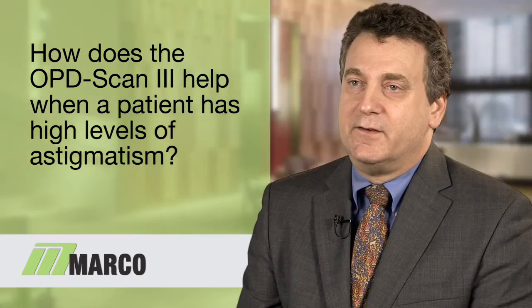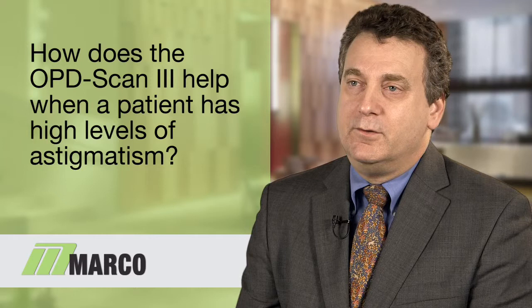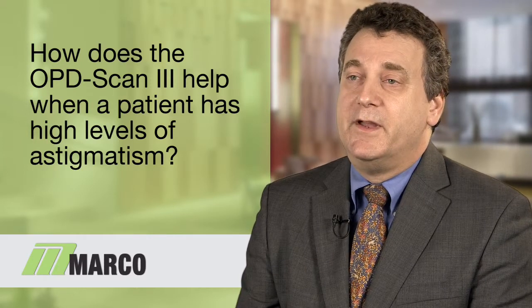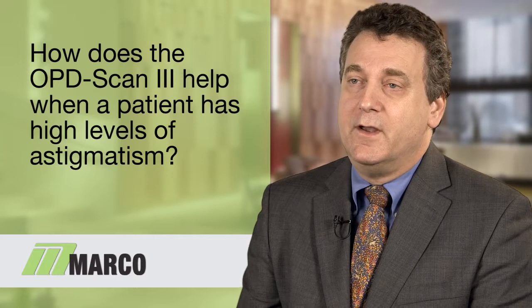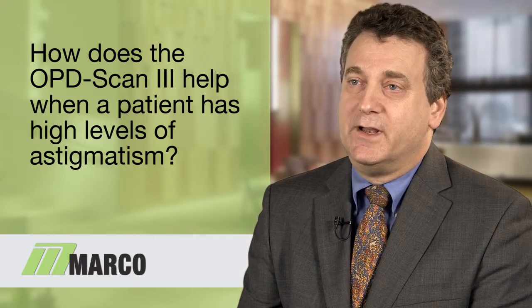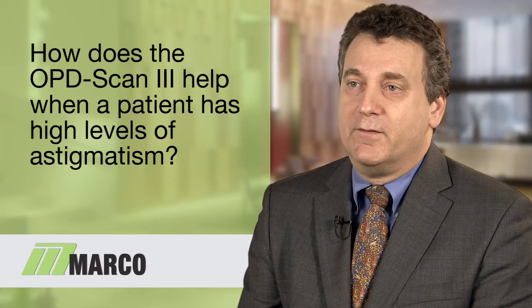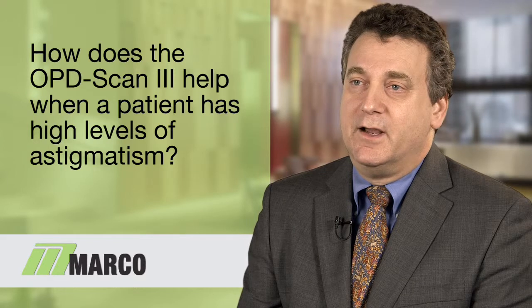The OPD scan is especially helpful in a patient who's considering a multifocal lens, but then you look, and they have astigmatism, and you also see that they have a fairly high level of higher order aberrations. So that's a patient where I'm very comfortable saying, well, I know you're interested in multifocal technology, but we're probably much better off going ahead with a toric lens. And it allows you to make that recommendation very comfortably for the patient.